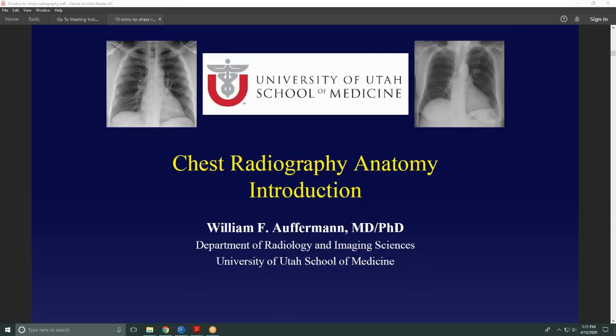So now I'm going to talk more about chest radiographic anatomy. Dr. Mann gave a talk earlier this morning. I'm going to be focusing on some different aspects than what he focused on. There'll be a little bit of overlap, but I think that the overlap will be healthy and a nice preparatory step forward into the remainder of this talk.